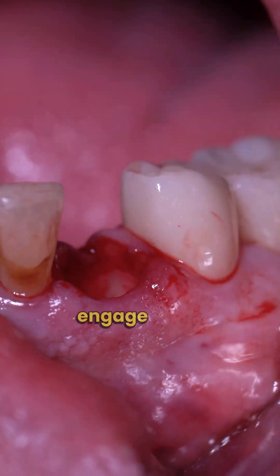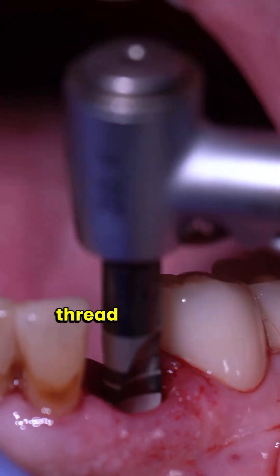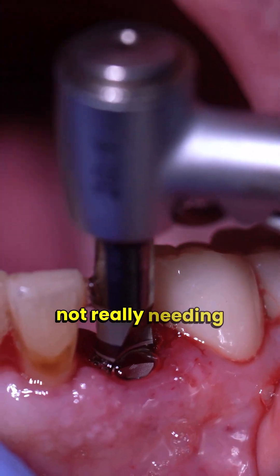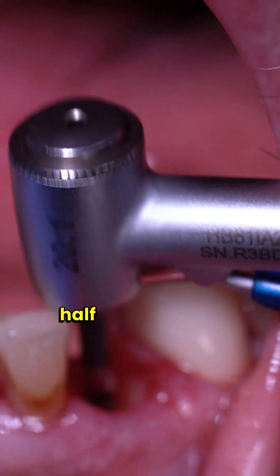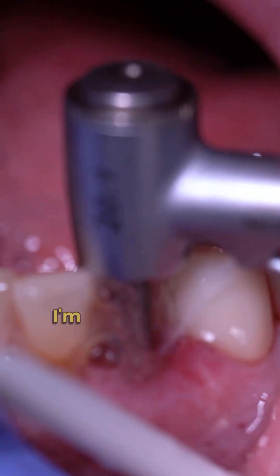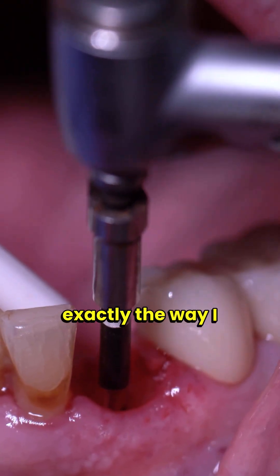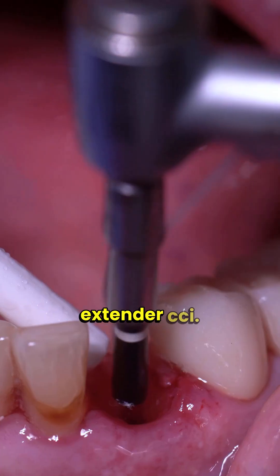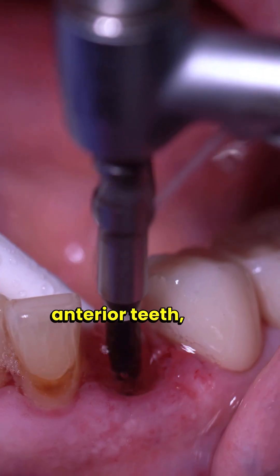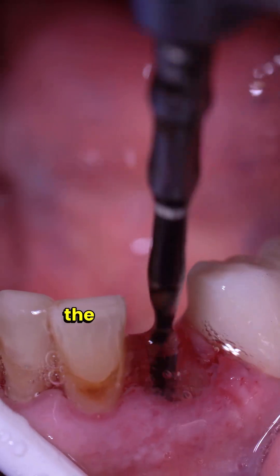When trying to engage it, it looks like it should get prepped a little bit — this is dense bone and you're not really going to just thread an implant in and get it to engage. With an immediate implant you're not really needing to prep most of the socket; the coronal half essentially doesn't get prepped. I'm going to go through the whole drilling sequence to make sure drilling depths and directions are exactly as intended. I'll be using an extender — I find I usually use extenders for anterior teeth — with lots of irrigation.